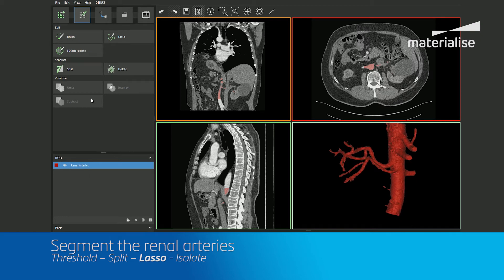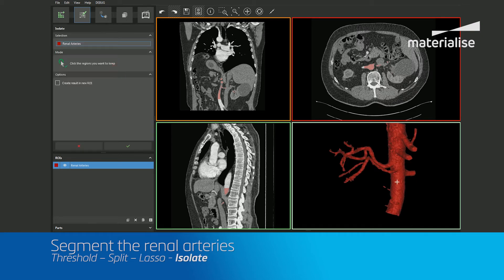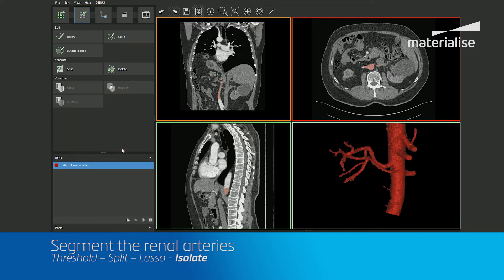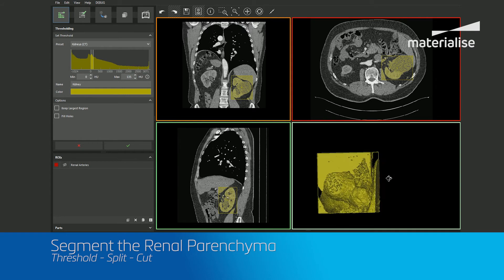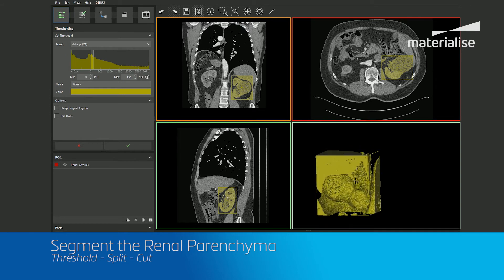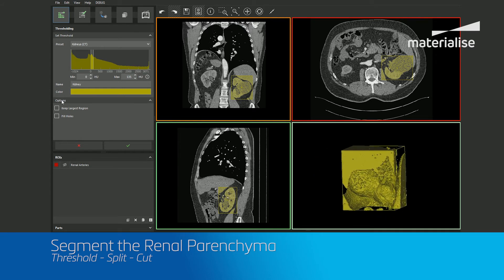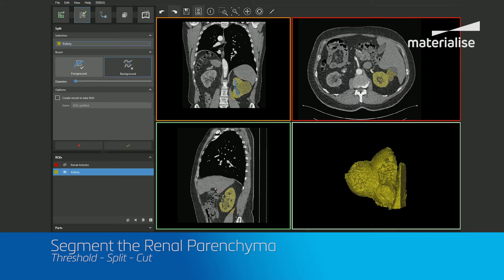After finishing our segmentation of the arteries, we will segment the renal parenchyma in a new region of interest by returning to the thresholding tool in the first step and performing a similar workflow as before. After thresholding, we will use the split tool to help isolate the kidney.